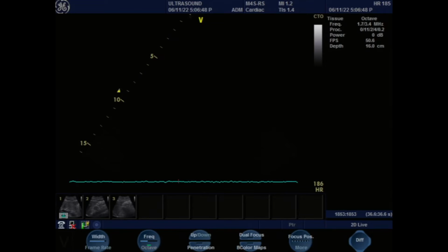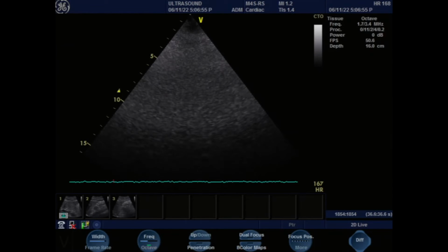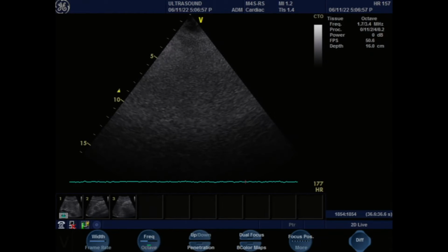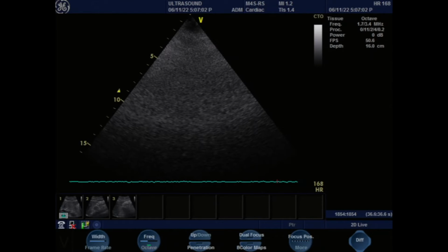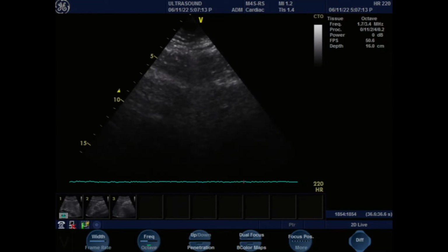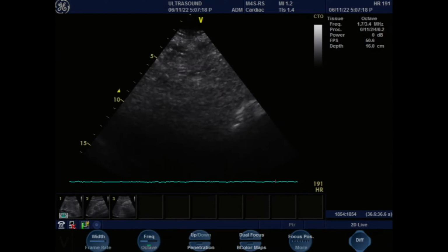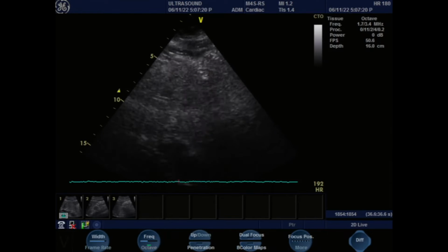Now I want to wrap this up with subcostal views. In the subcostal views, we're looking at the inferior vena cava. So the subcostal view is easy. What do you have to find? You have to find where the sternum ends. You put it right there, and this is the point where your probe is going to go to look for the subcostal view. The probe is going to be parallel to him.